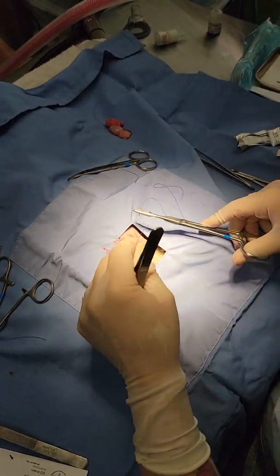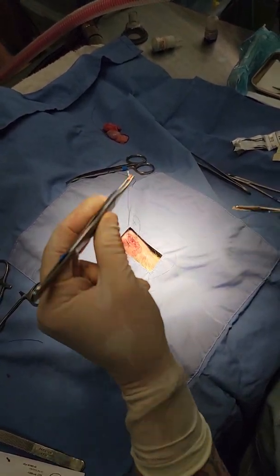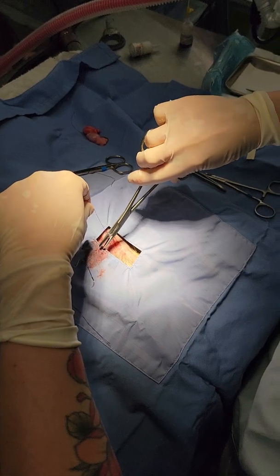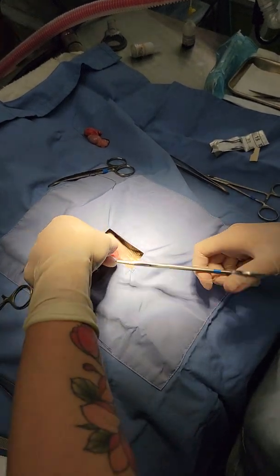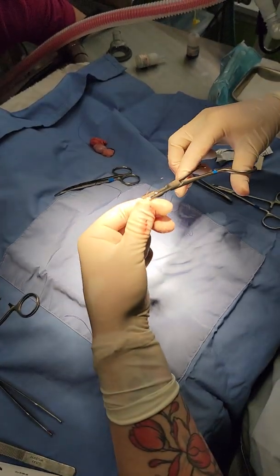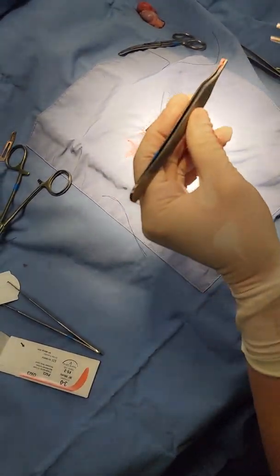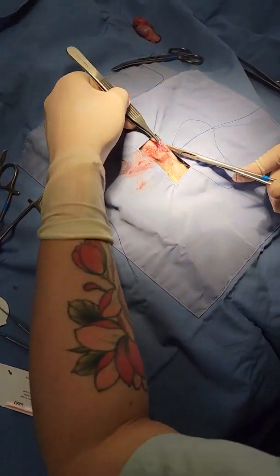The other thing you obviously have to be careful of is that you're pretty close to the bladder, and it's not uncommon to inadvertently grab the bladder fat and exteriorize it thinking it's a testicle. Over time you're going to see that the testicular fat looks very different — it's much more friable than the regular fat in the body. For guinea pigs that are really big, I try not to remove more of that testicular fat than I need to, because there is a potential risk of intestinal herniation. But I did have an exotic specialist tell me that it does tend to kind of fibrose down, so it doesn't seem like as much of an issue after a couple weeks after surgery.